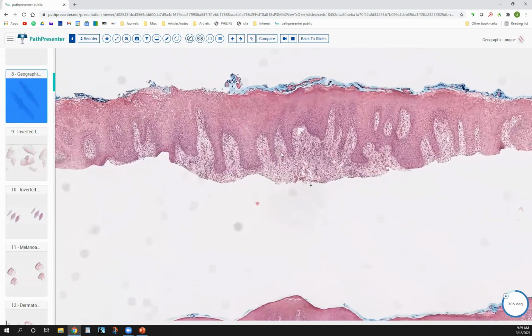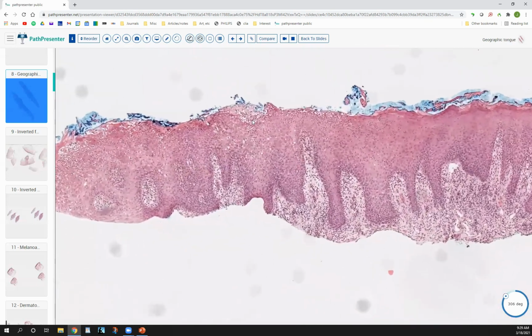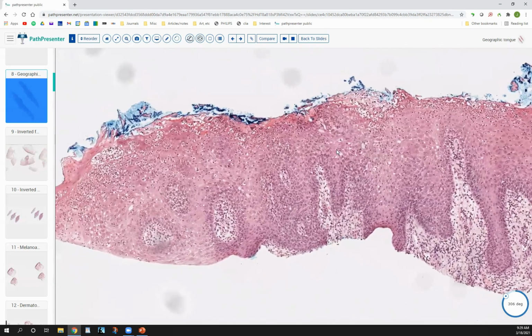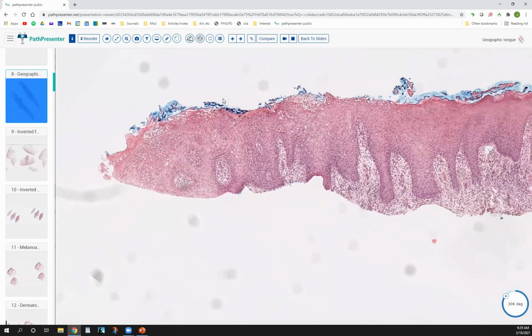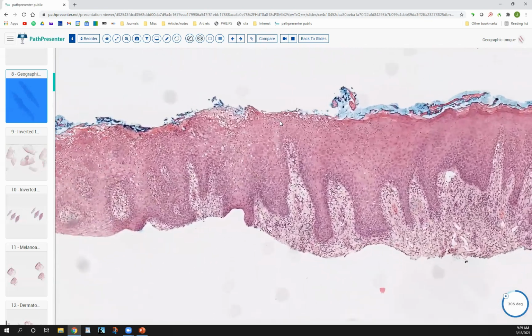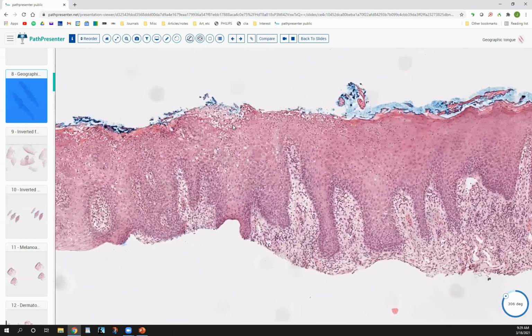As you scan around a little closer, you may see this right here, neutrophils within the oral mucosa. So similarly to how you would do it in regular skin, you can think about the differential diagnosis of neutrophils in the epidermis or epithelium. So you want to rule out your candida, your tinea, psoriasis, maybe syphilis, and impetigo.